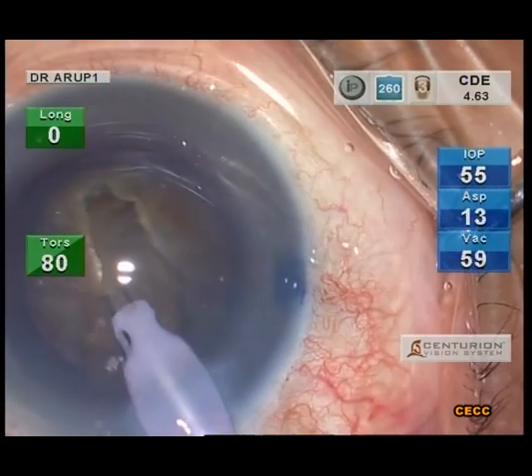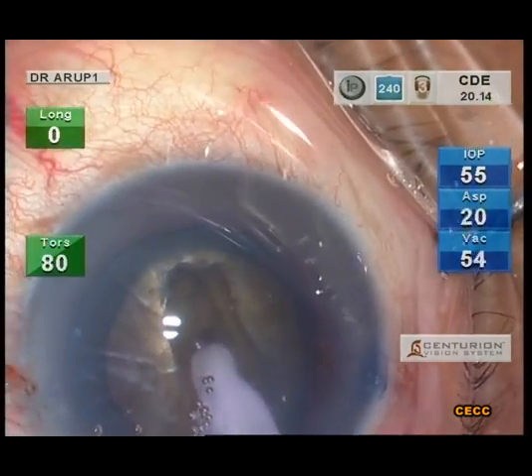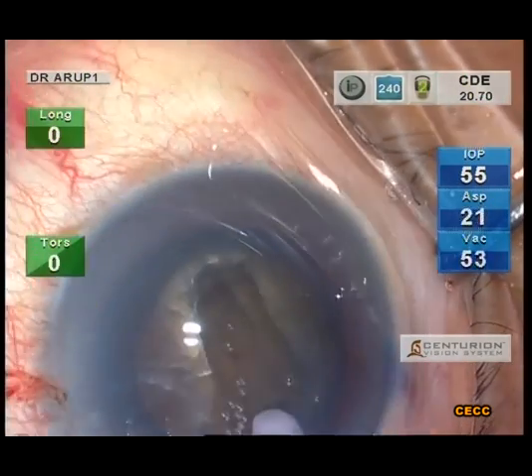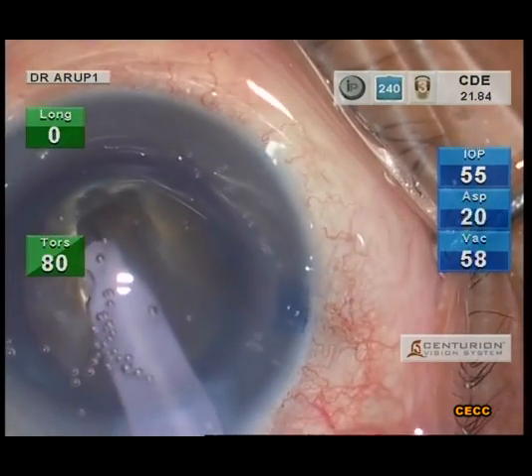It is necessary to shave the side walls of the groove to give easy access to the phaco tip and sleeve combo to the floor of the groove. This enables the tip to reach the trench floor for further deepening.